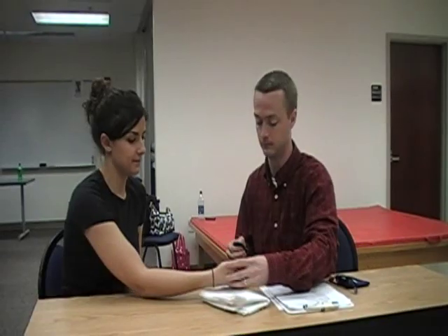Elizabeth, we're going to have you close your eyes, and I want you to tell me if you're feeling one point or two points. We normally would start with the five millimeter, which is slightly less than the six, which is usually the normal, because it allows us to have a good starting point.